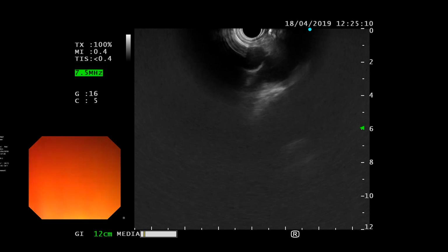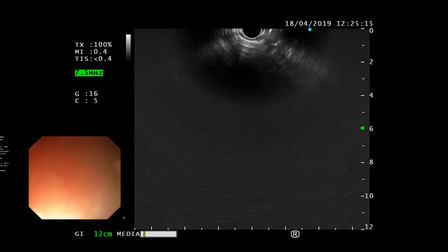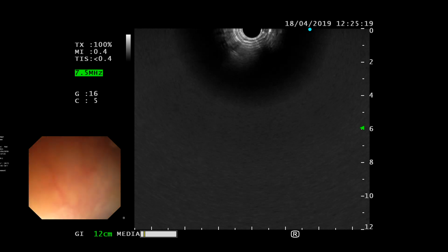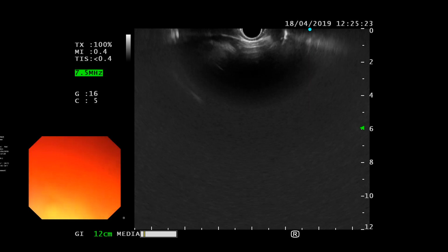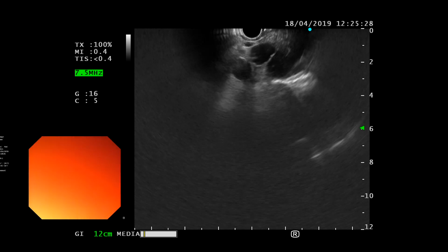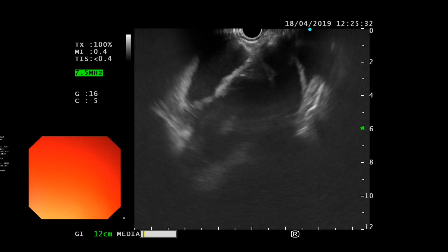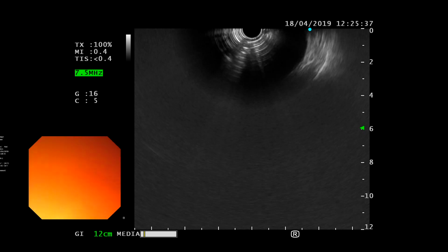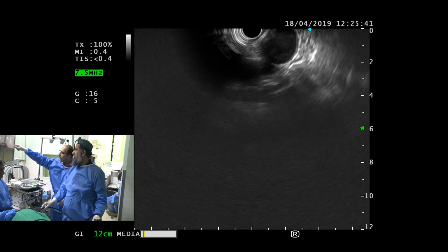So spin the other way. Make sure you have your thumb down a bit so that you don't get artifacts. Big wheel down a bit, towards you. And don't pull just yet. Just go counterclockwise. That's it. Now pull back. Find the aorta now. There's the aorta, right? Now keep pulling till you have the arch.